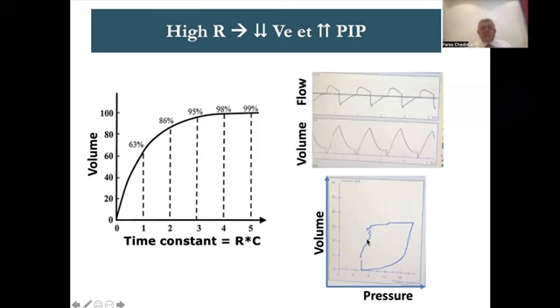So this patient is shouting to me, I have short I time because I have high resistance. High resistance causes a high time constant, so the good I time that you gave me is not enough anymore. Please do suctioning of the ET tube, unblock my ET tube. It's not totally blocked because there is flow, but suction my ET tube and then the I time will be enough without necessarily increasing the I time.